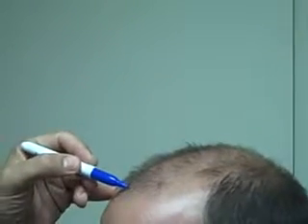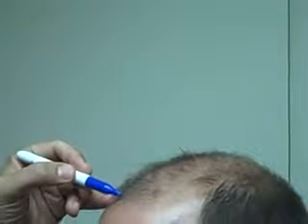W. Okay, I'm going to show how I like to mark out patients. It's a nice teaching example. That was a good idea, Jackie. Okay, chin up for me. We had talked about doing a little bit of conservative lowering along the sides, and I'll go ahead and mark that out for you. You're 37? Yeah, so we want to go reasonably conservative.